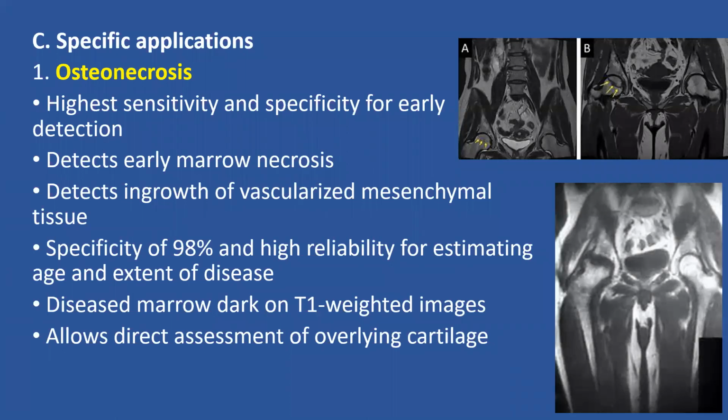So you can see how important an MRI is in diagnosing osteonecrosis. Mind you, let me tell you something. CT scans can quantitate the amount of necrosis of the head of the femur or any head, like in the humerus. But what gives us details in osteonecrosis is MRI.